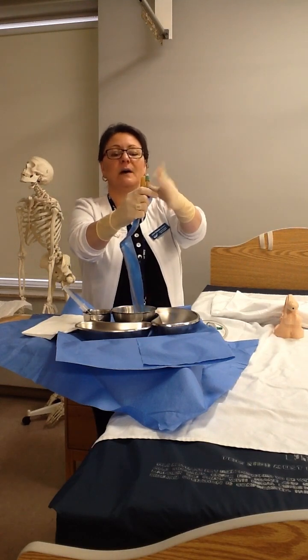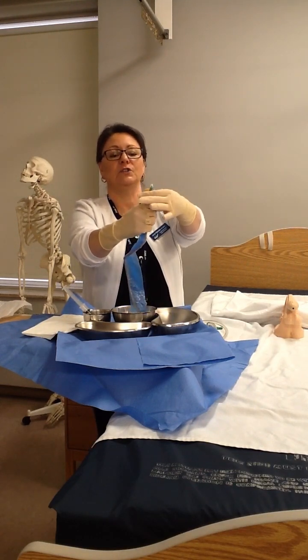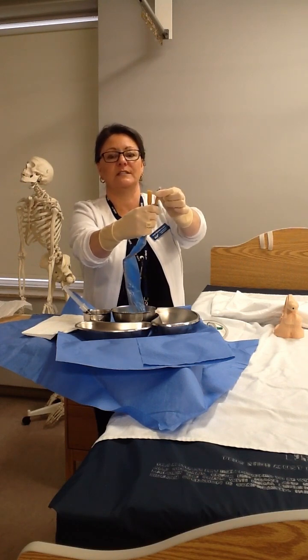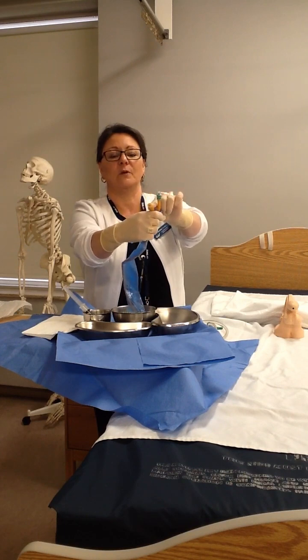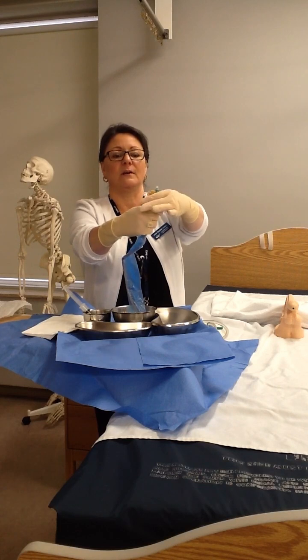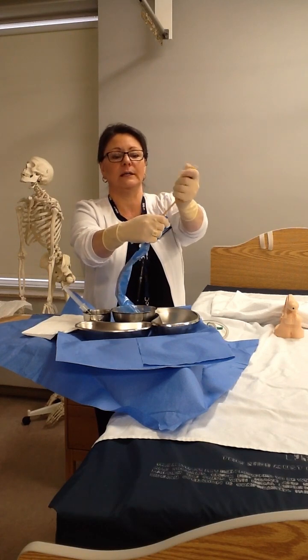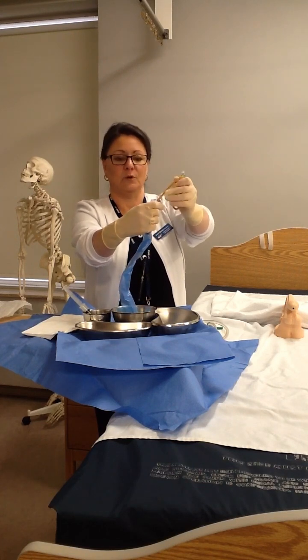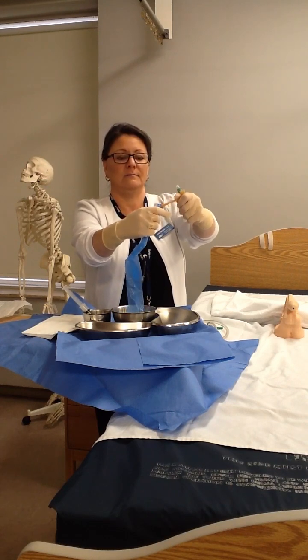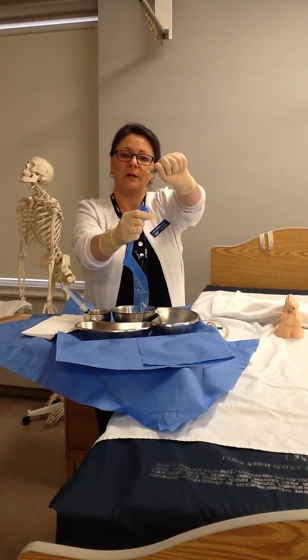So I'm going to use my left hand and get a good grip on those 2 lumens right now. This green one is the one the syringe is going to attach to, and this other open one is the one the urine is going to flow out of. Okay, so I'm going to get a hold of them and start coiling it up in my hand. As I'm pulling it, it slides right out of that blue sterile package. Okay, I'm going to have it coiled up in my hand.